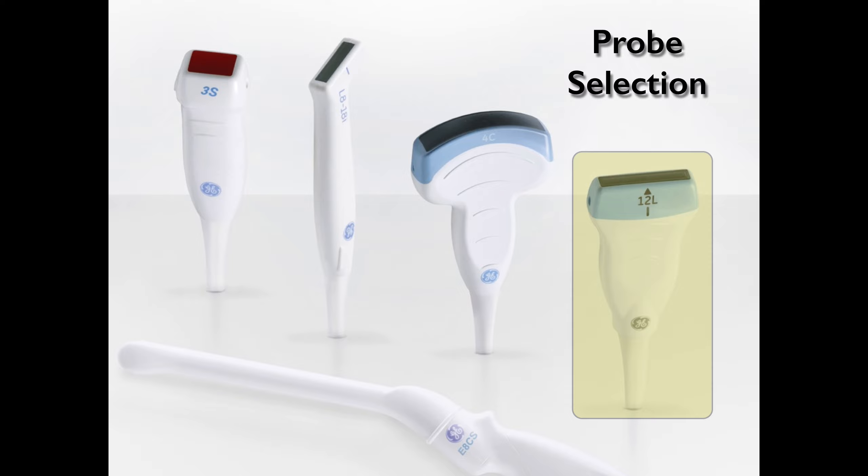Regarding the probe you're going to use, in general you're going to use the linear probe because the veins are pretty superficial. Sometimes you might use a curvilinear probe, but that's very rare — that's more for patients who are obese or bigger and you can't penetrate enough with the linear probe.